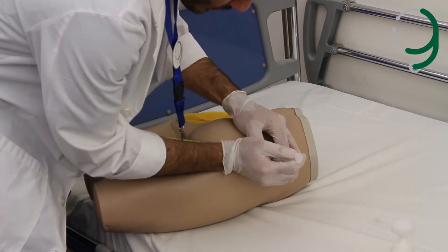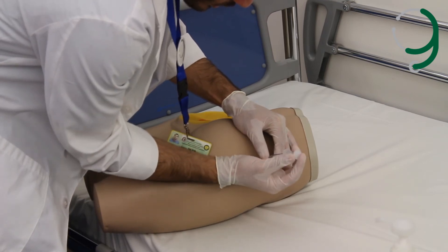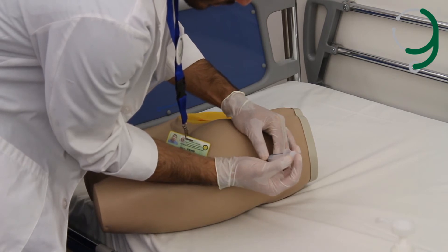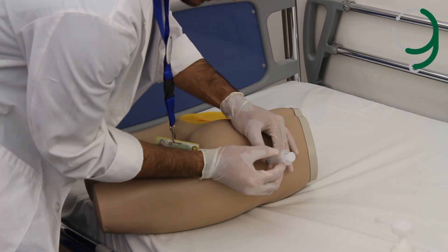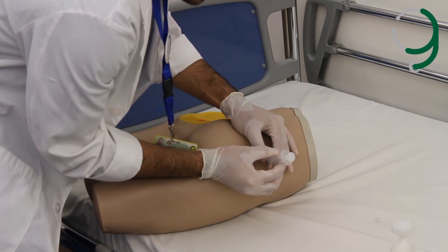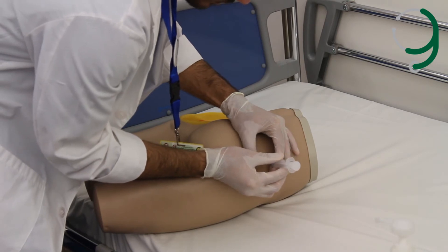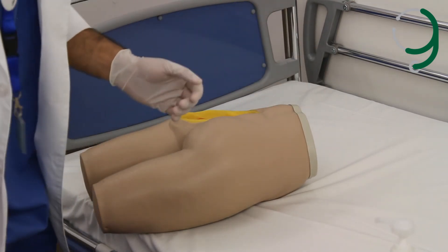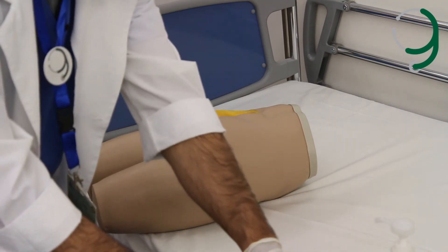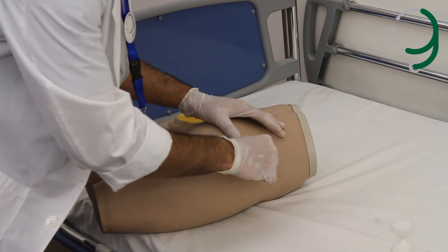We aspirate just a little bit to make sure we're not in a blood vessel. Then we inject the medication slowly. We wait for 10 seconds, then draw the needle out and remove the non-dominant hand. We wipe it again with the alcohol swab and put a plaster if needed.